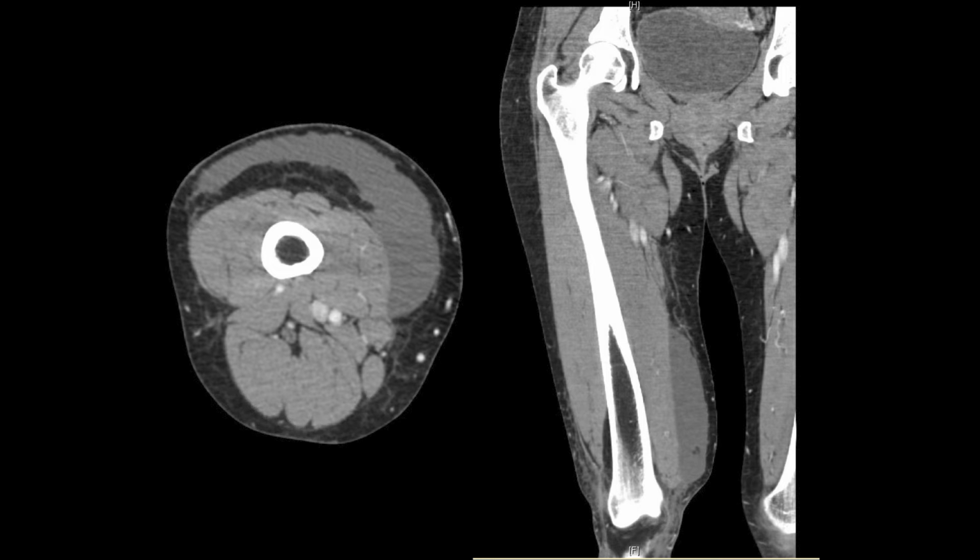So you have that, you can see obviously the bone in the middle, right? You can see the muscles surrounding that bone, some subcutaneous fluid superficial to the muscles, but then there's that large fluid collection. Obviously, this is a different patient because it's not in the same place as the last one. You can see that large fluid collection in that subcutaneous layer.